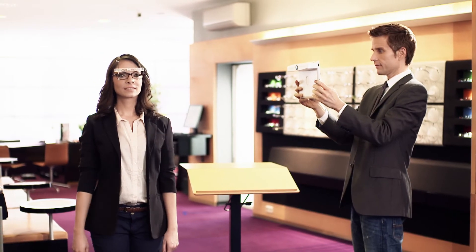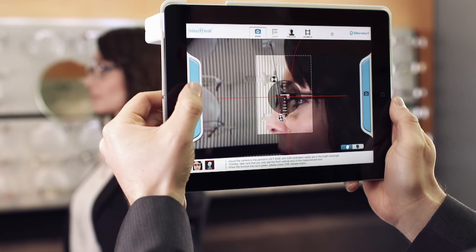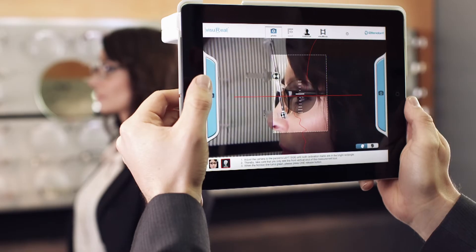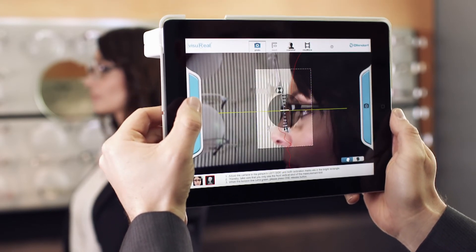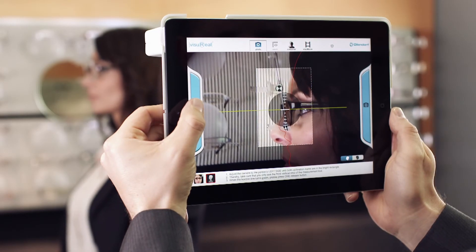Ask your patient to turn sideways by 90 degrees and take the side view picture. Check the natural head and body posture of your patient again. Both calibration marks and the eye have to be in the bright rectangle. The horizon line has to be green. Make sure that the front spring strut covers the rear strut in the picture so that you only see the one in front.